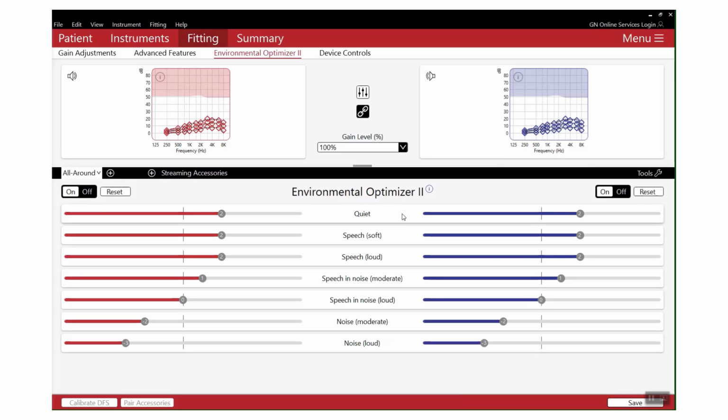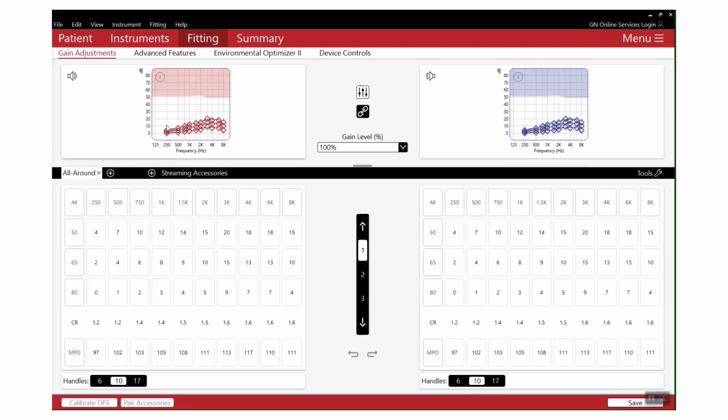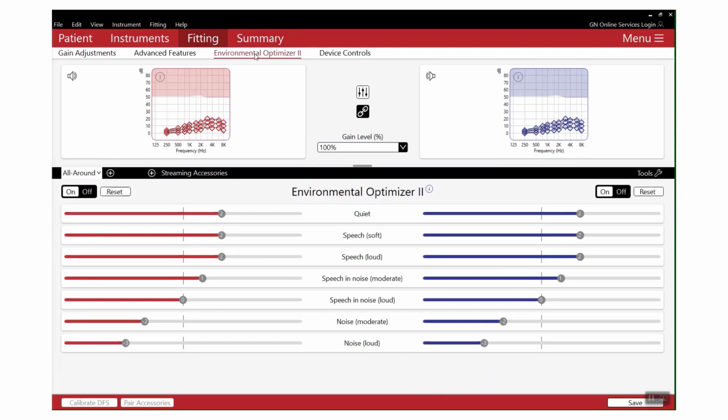So how do we use it? Think of it as an automatic gain adjustment. If somebody comes in and they present you with an issue, for example, they're struggling with soft speech, instead of being in your gain adjustments and making adjustments to specific gain handles within your fitting here, you can go into Environmental Optimizer or Environmental Optimizer 2 and increase the gain specifically for soft speech at a level that's comfortable for your patient. Why would you want to do this?